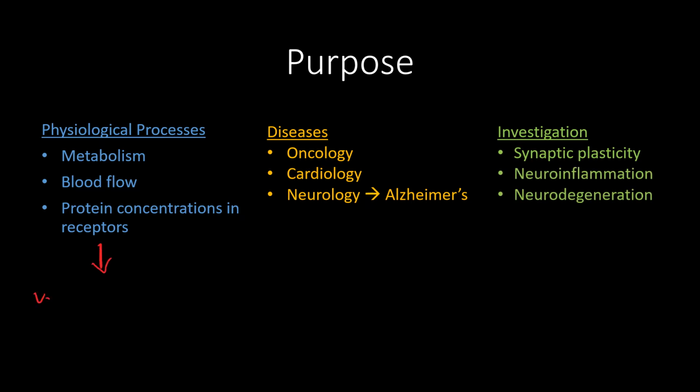In research, PET is used to visualize receptors and determine their occupancy, which is useful in clinical trials for new treatments. It can also provide information on the molecular level before any structural and anatomical changes are present by targeting proteins. This makes it a very useful technique.